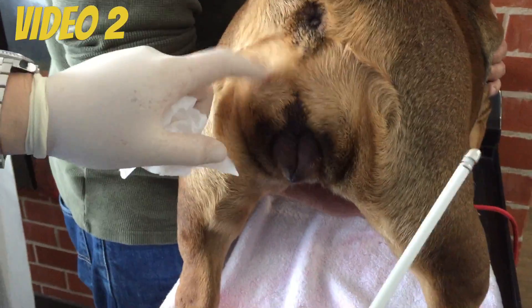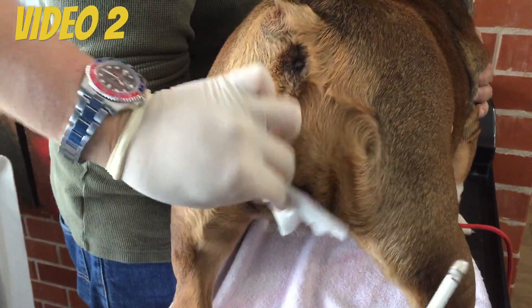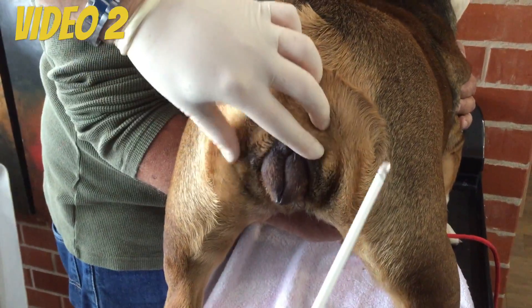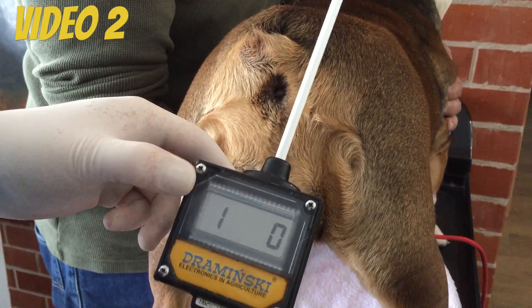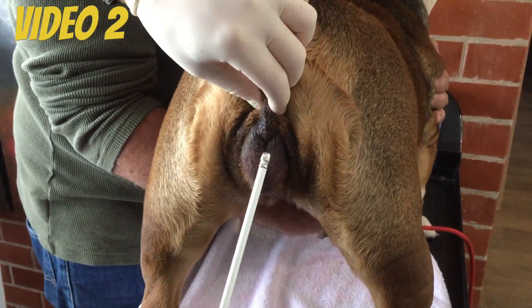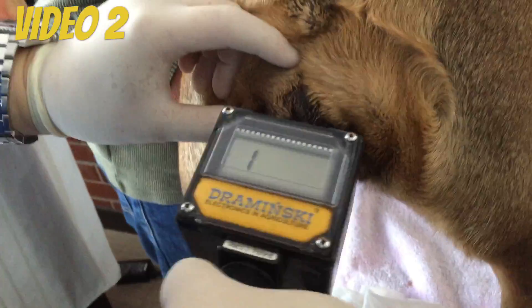I mean, she's not ready yet. So let's see what this gives us today. You want to make sure you want to clean that really well so you don't give her a bacteria infection.